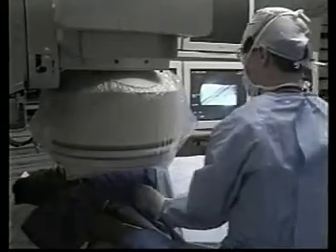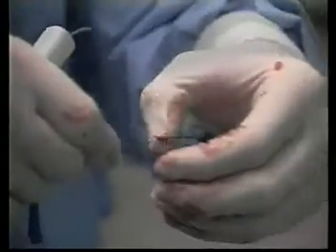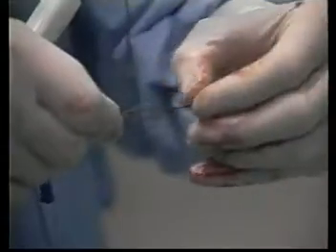When the basket reaches the tip of the access sheath, place the device in the compressed position. Advance the tip to the arterial anastomosis and repeat the process. When the 2 passes have been completed, remove the device from the sheath in the compressed position. Manually remove any accumulated fibrin from the fragmentation basket.